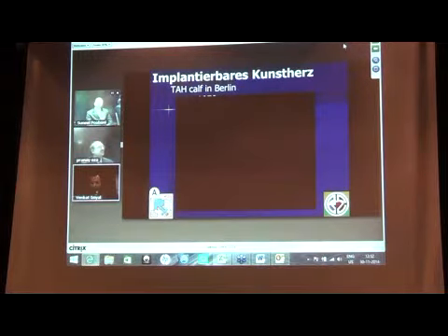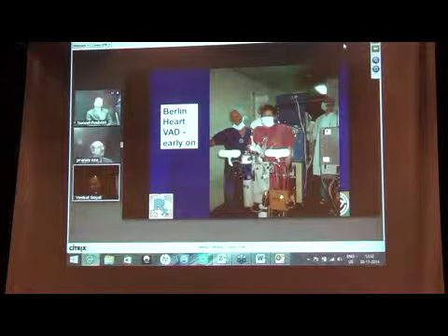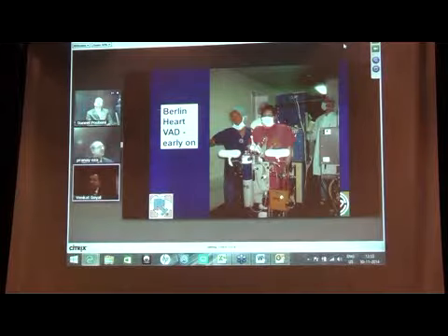Okay. So then in the 1980s it came to human experiments. In a human experiment you can see the entire blue thing in the rear of the patient. This big was the console, and the patient was almost bracketed in the console. But that was one of the successes. They could maintain the patient whose heart was not working. But this was the situation in the 1980s.